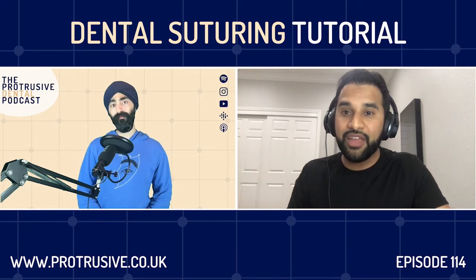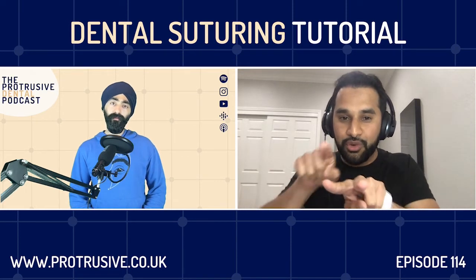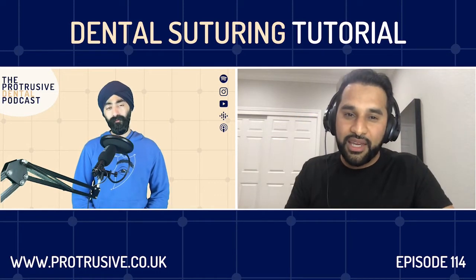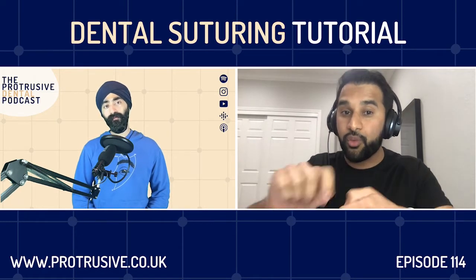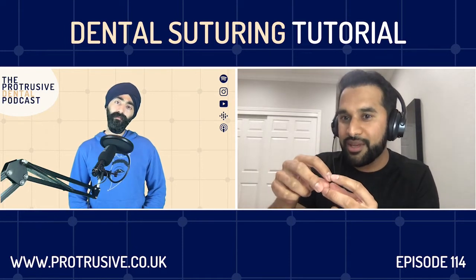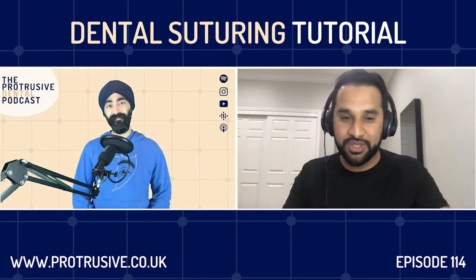2-1-2-1. Okay. And the reason for it is, when you look at your knot, the 2 forward throws, it's like 2-1-2-1. The knot just locks on itself. And there's something called the square knot, which is generally 1 forward throw, 1 reverse throw. But 2 single throws can actually unravel on itself a bit, but technically we're stacking the actual surgeon's knot. And that's just so much more secure.